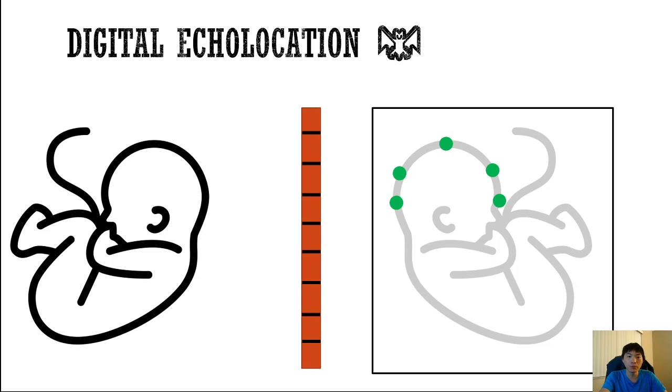So what you can see is as we go down the different channels in the transducer in sequence, eventually we can observe all the reflections and the locations of where the reflections come from. And so we get an image of the boundaries.